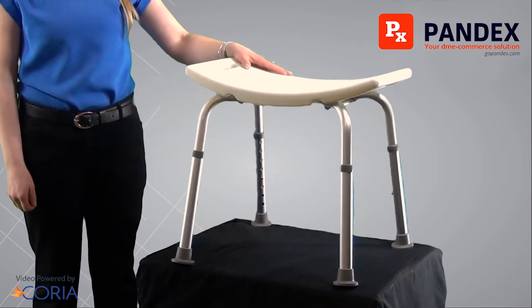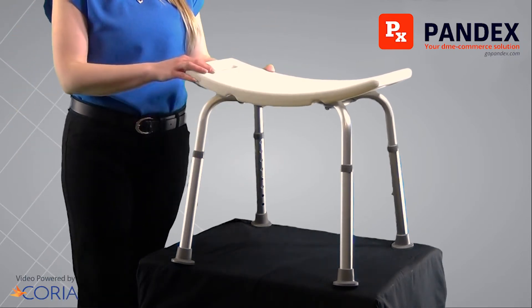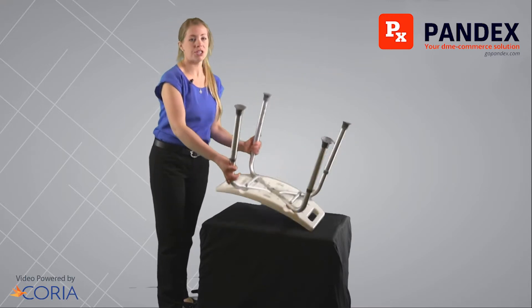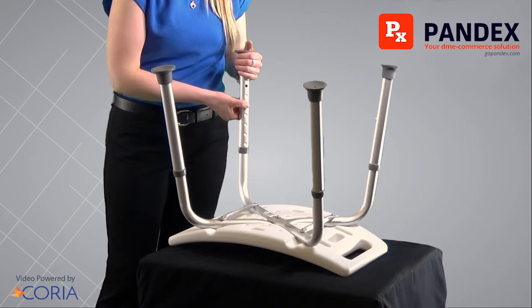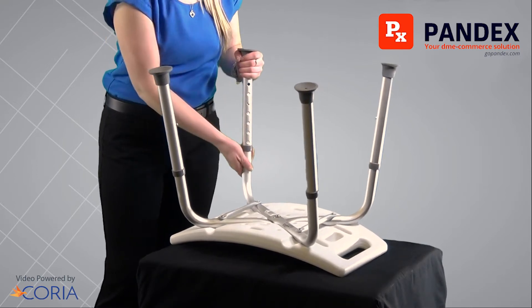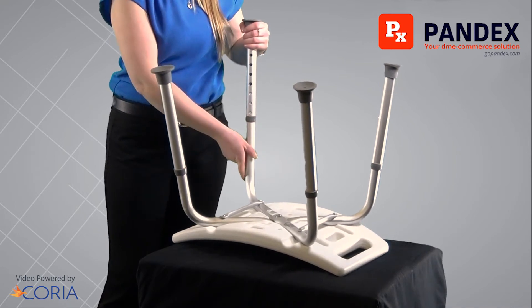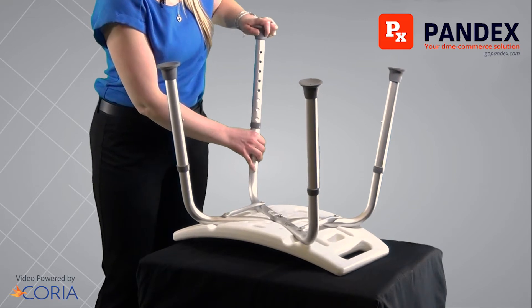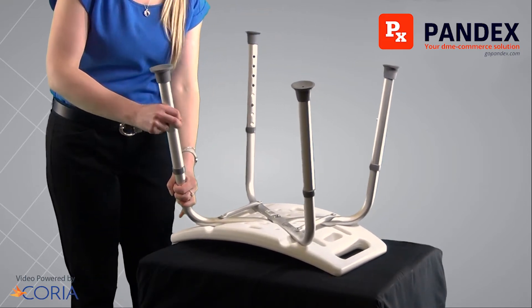The shower chair is adjustable by all four legs so you can get it to the appropriate height. To change the height of the legs, you can flip the shower chair over and press in the buttons. Once the button is pressed, you can pull the leg up or down depending on how high you need the shower chair to go. Once you get one set into place, make sure that you do the same with all the other legs.